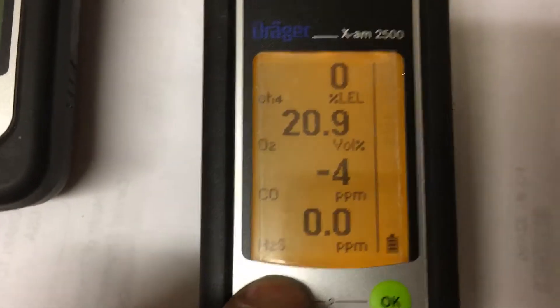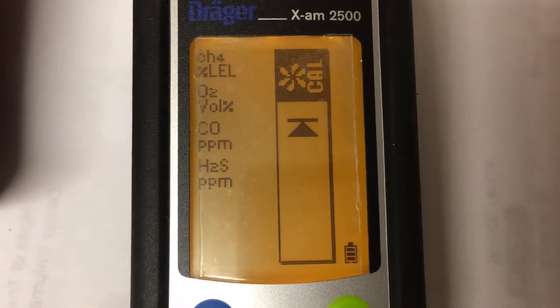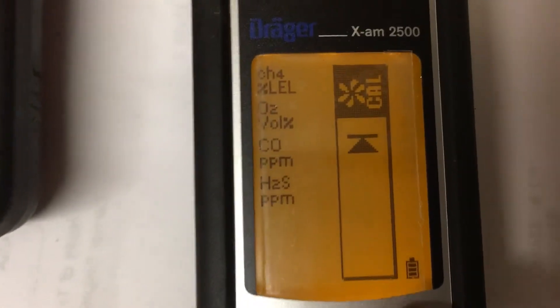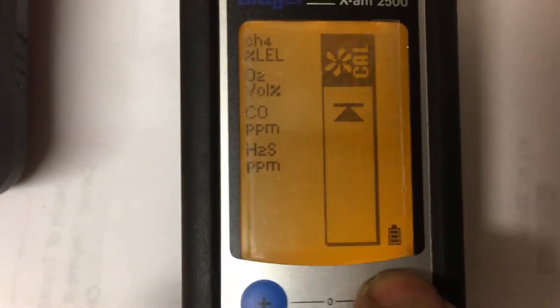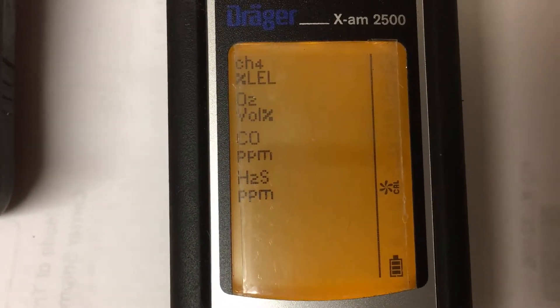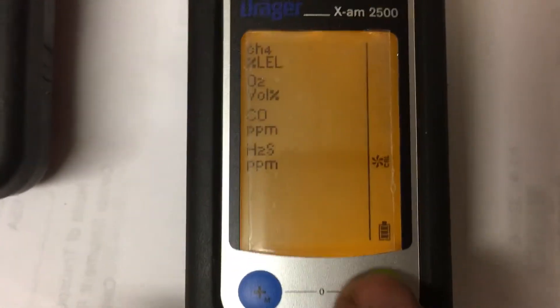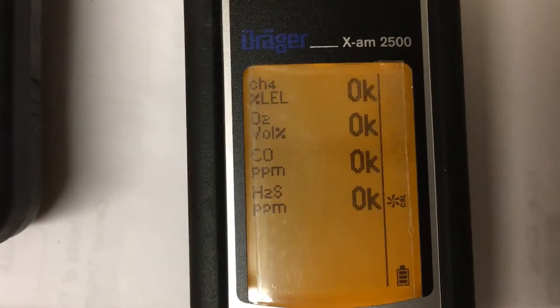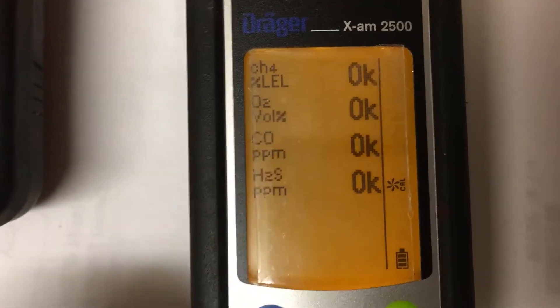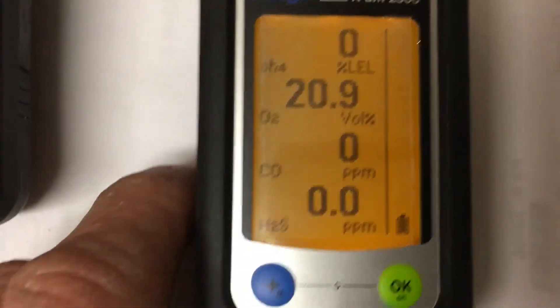The first cold device is warmed up now, so I'll try it: one, two, three — push the green button. You can see the numbers change — there was a minus four there — it's doing the fresh air cal. Push the green button again, everything says okay, and now it reads zero. Push the blue button and everything is zeroed and good to go.